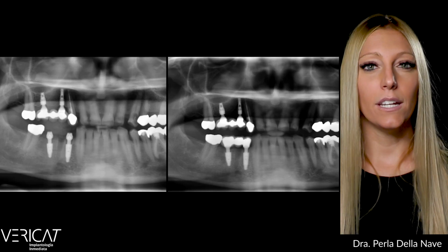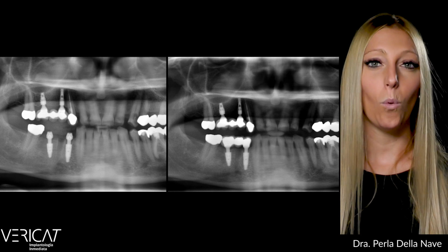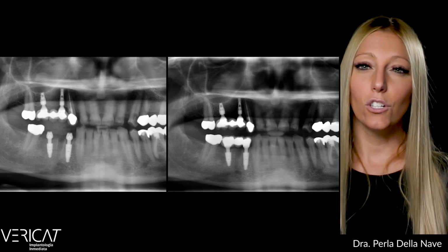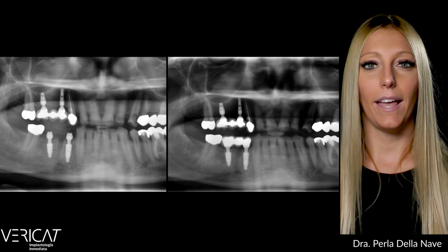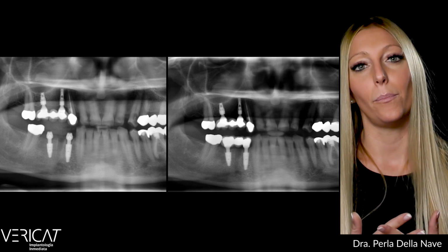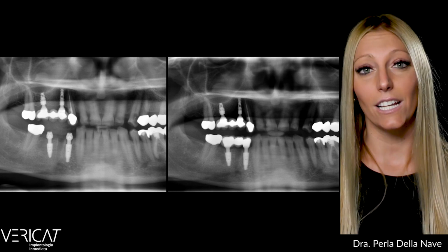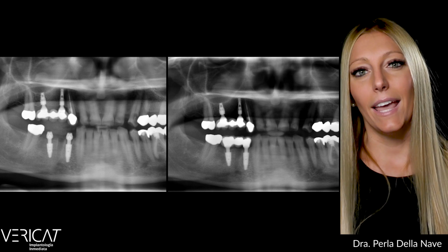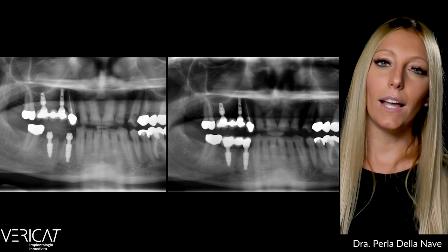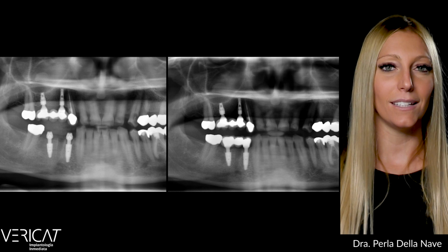Another example, we see here a partial rehabilitation on 2 implants on the right mandibular side, one of them being a post-extraction implant. And again, we can see the level of the marginal bone that remains stable and after 2 years continues to perfectly protect the shoulder of the implant. And we can also compare this image to that of the section of the first quadrant, a treatment which is approximately 1 year older. The concept is similar, so slight subcrestal positioning, platform switching, but it's not as extreme as the one applied in the lower jaw.